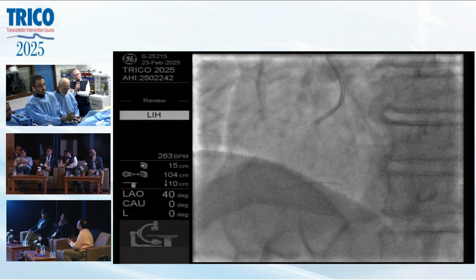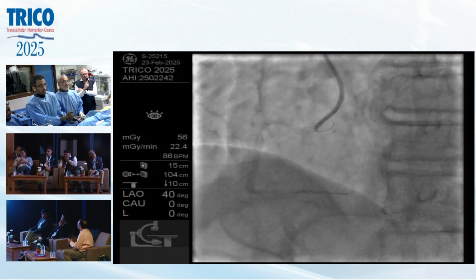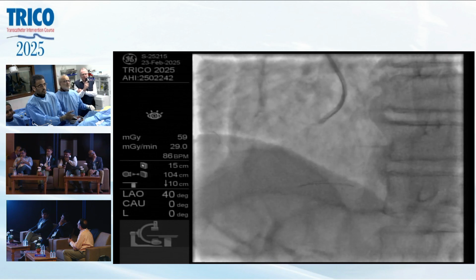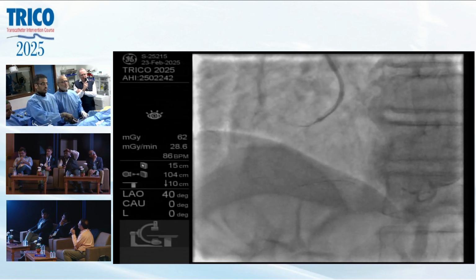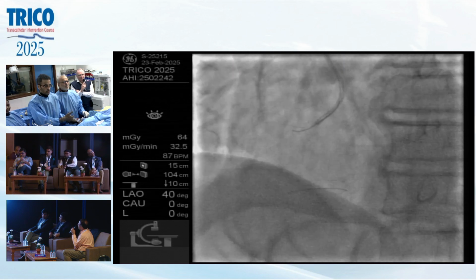Tejas, your comment there about your plan to use this other stent, that you think this is going to go very nicely. Yeah. It reminds me, the very first GR2 stent that I put in was actually an anomalous circ. And no one thought it was going to be able to be advanced. This is a long time ago, but it just reminded me of that story. You're really dating yourself now.